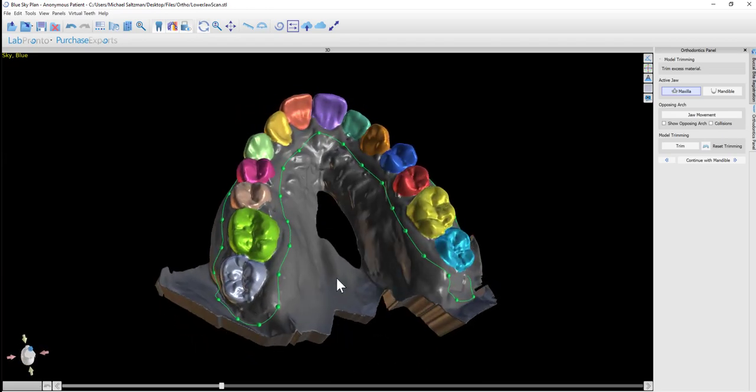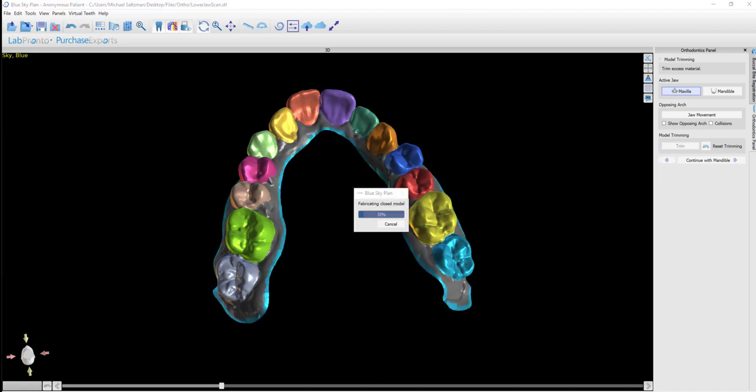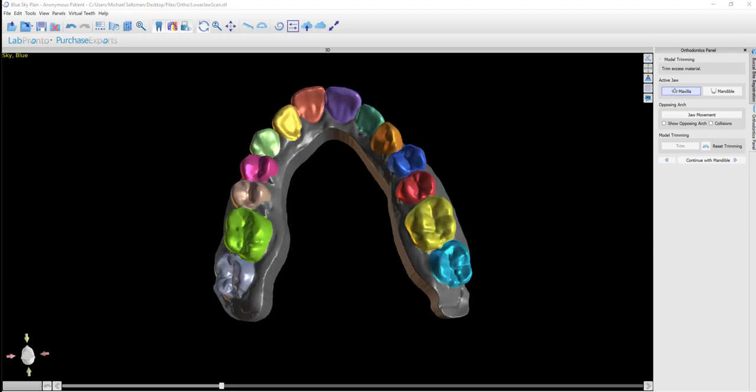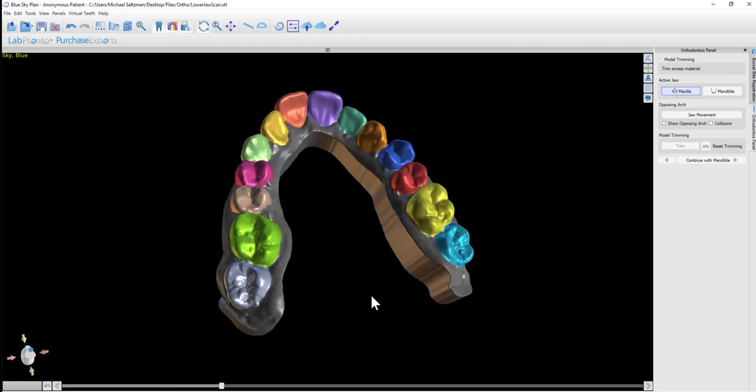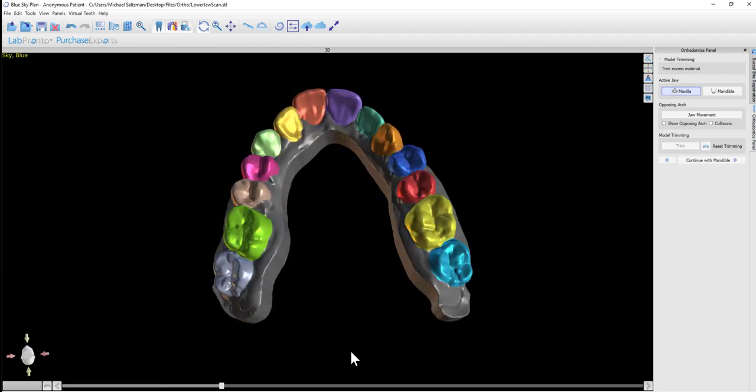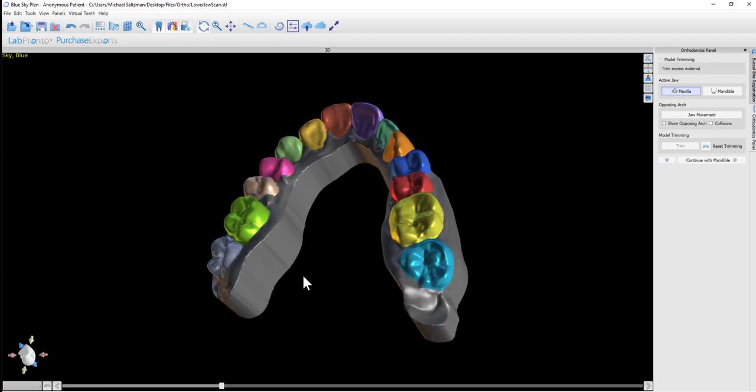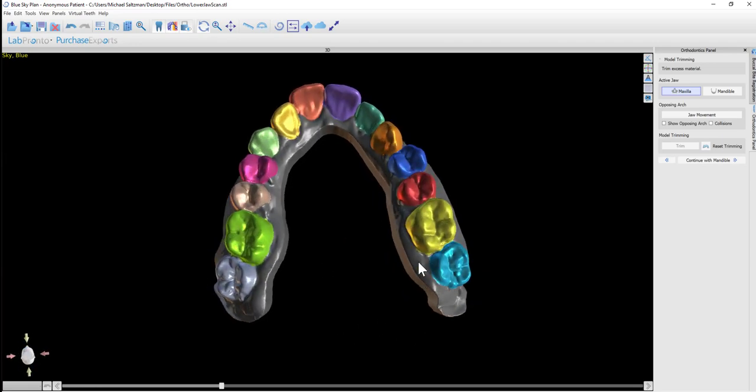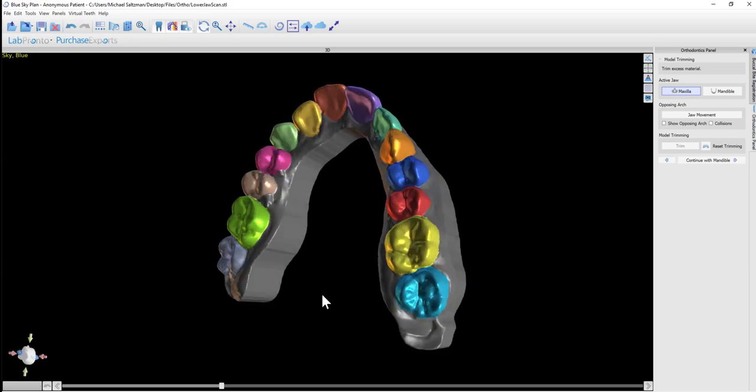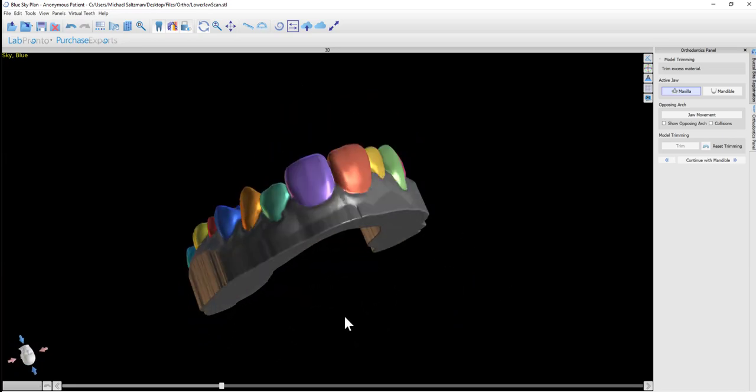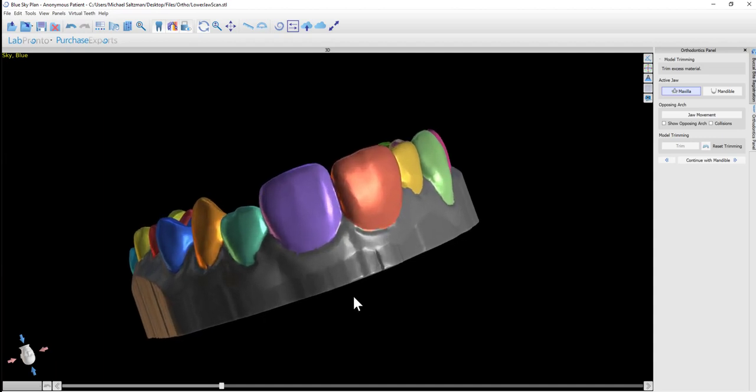Once we're happy with the curve, we click the trim button. Now we have a much cleaner model, reducing print time and material while eliminating potential errors during printing. Looking at it, we can see the height difference between what was above and below the trim curve.